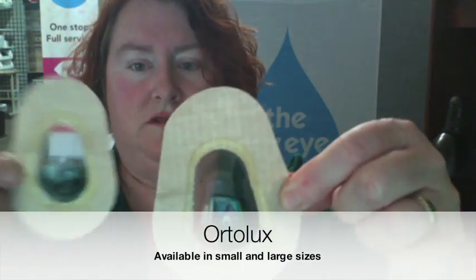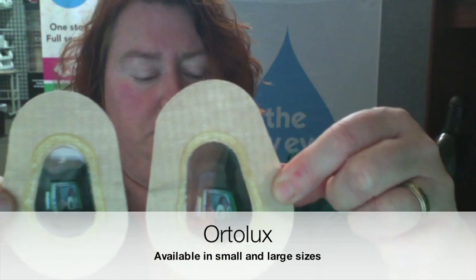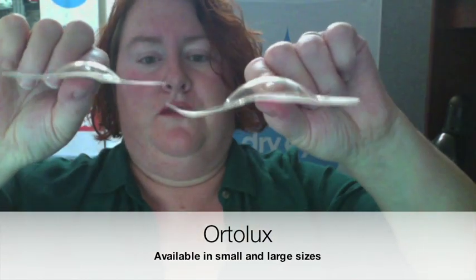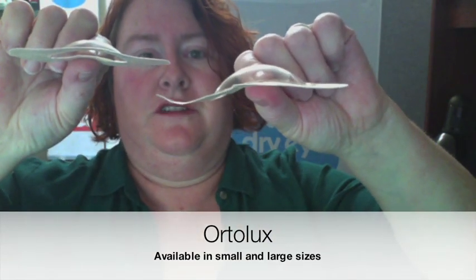Next one is the Ortolux, and the Ortolux has two different sizes: large and small. Going back to the Night Eye for a second — here's the height of the bubble on the Night Eye. It's really quite tall compared to the Ortolux, which is a pretty shallow sort of thing.